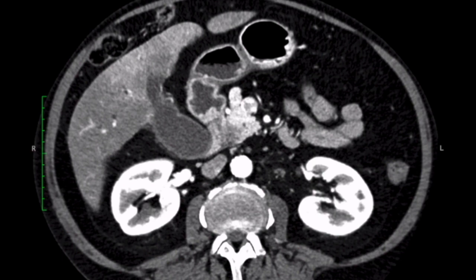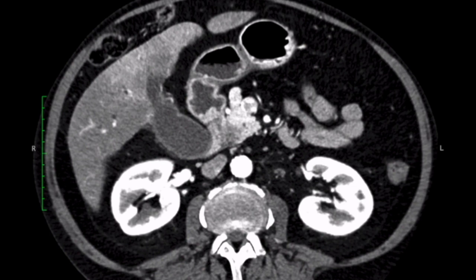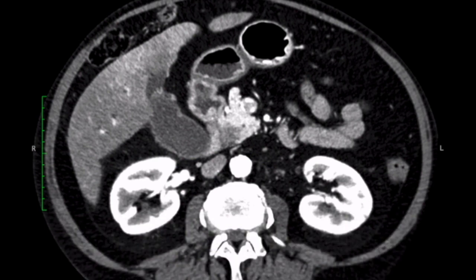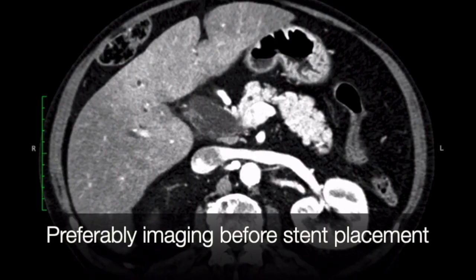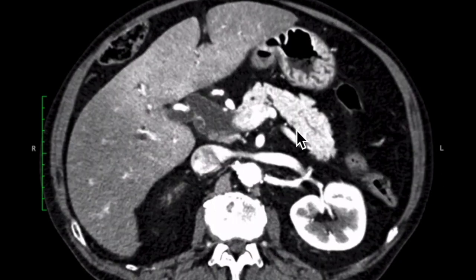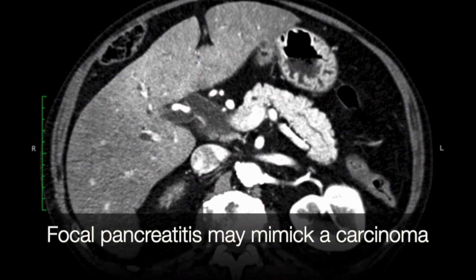The second step is to assess morphology. This is clearly a solid tumor without any cystic components. We can measure the size and look at the enhancement pattern. This lesion is hypovascular compared to the vivid enhancing normal pancreatic parenchyma in the arterial phase. We can also look at the amount of bile duct dilatation and note if a stent has been placed — mention that in your report. Preferably, we perform imaging before stent placement. We can also assess the normal pancreatic parenchyma; there are no signs of chronic pancreatitis, as focal pancreatitis may mimic a carcinoma.